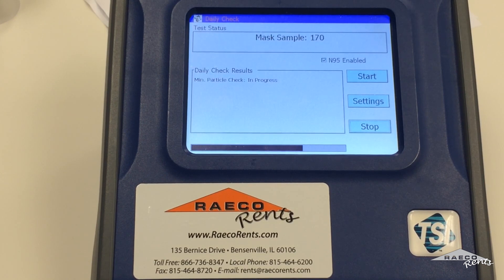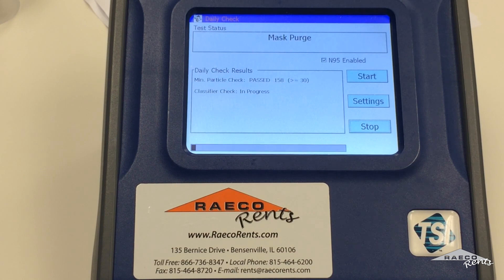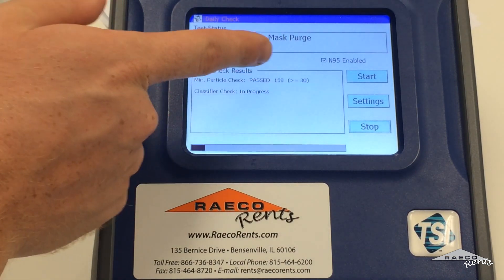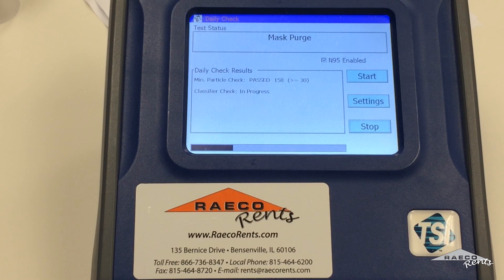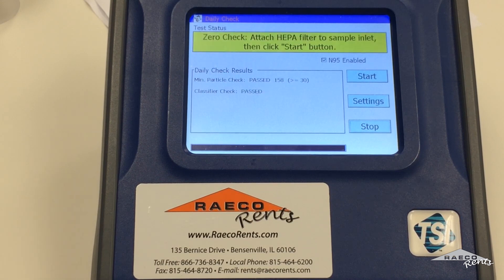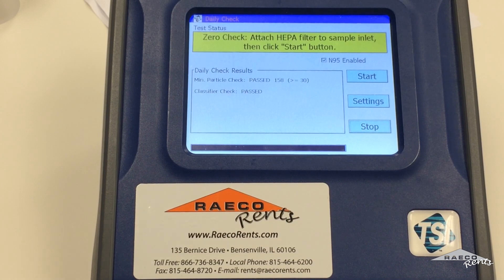Now this takes maybe 30 seconds or so — it's real easy. You'll notice if you get under 30, that's when you have an issue and it won't pass. If that happens, you might need a particle generator for your PortaCount if you're not getting enough particles in the room. All right, so that's the first part of the daily check done.